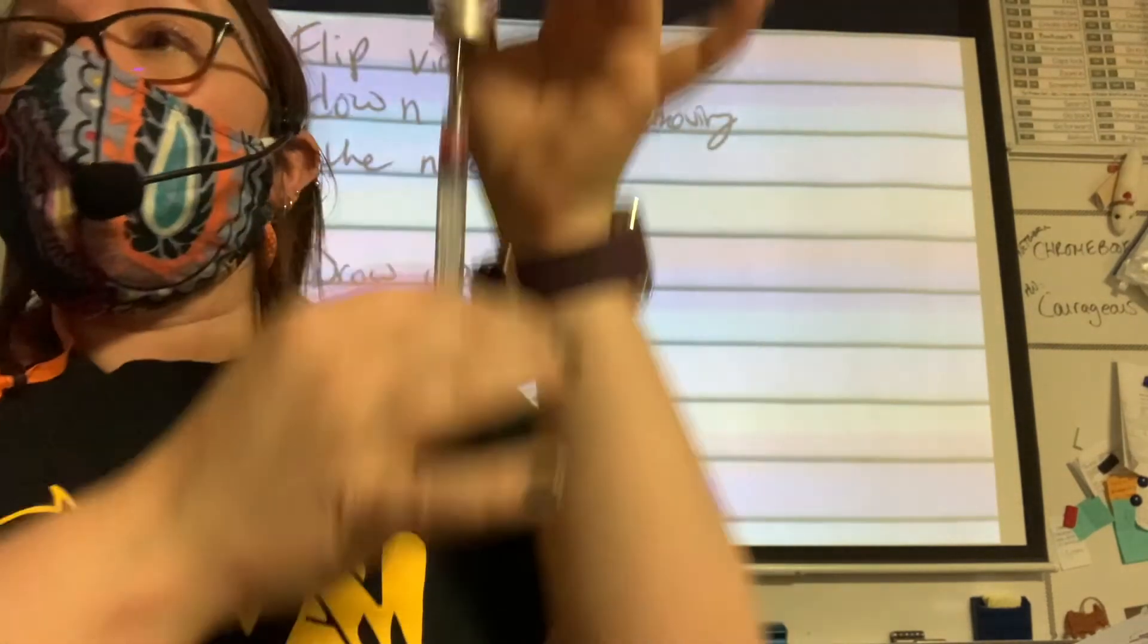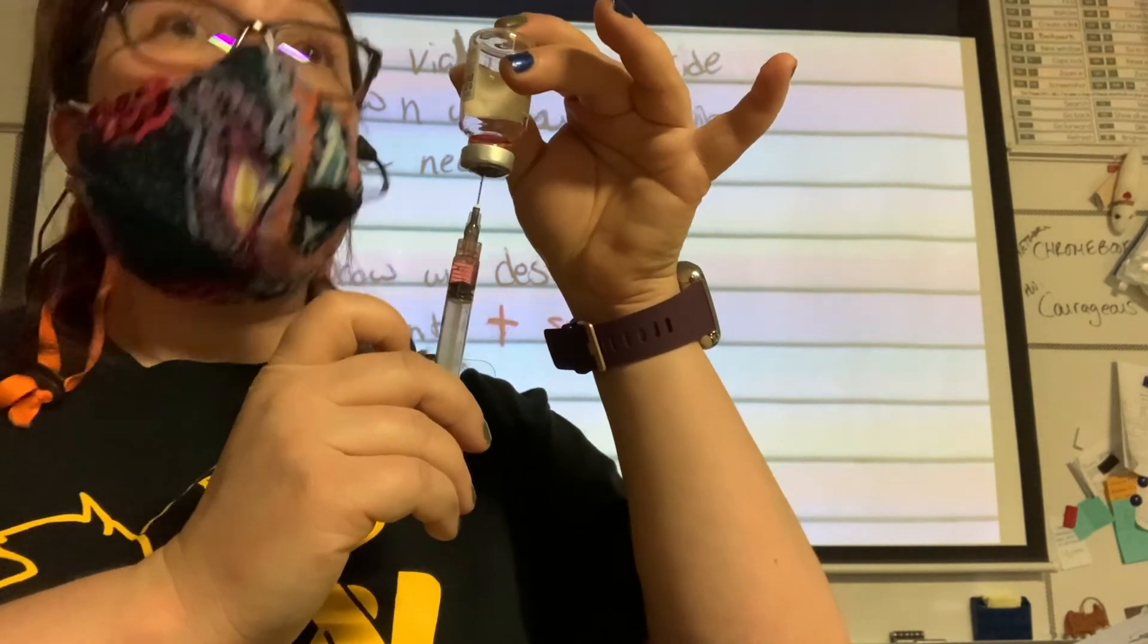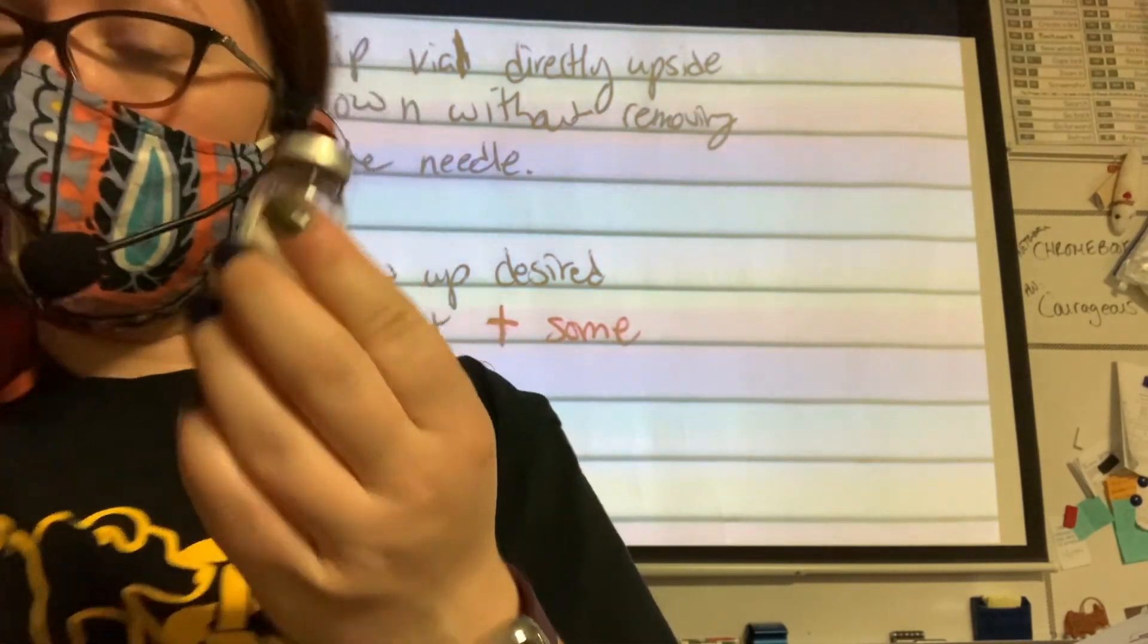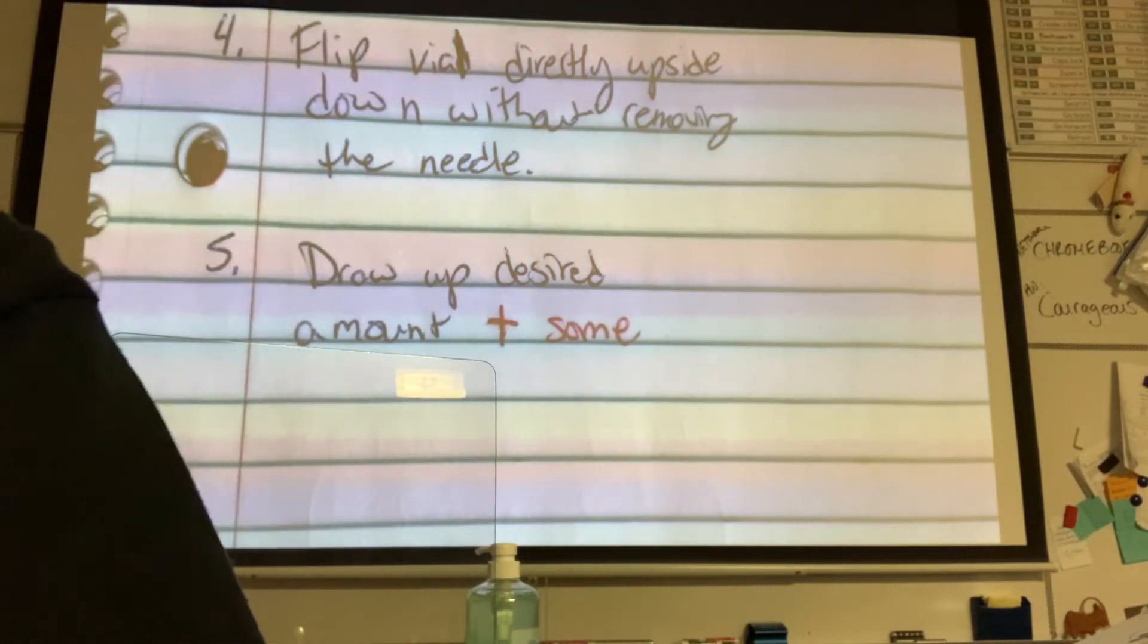So step eight is the student places syringe in the sharps container. After I get how much I want, and you guys will notice the needle is going past the liquid. So all I'm doing is pulling that down. Once I have what I want, my 0.5, if I pull straight out right now, my bottle, there's a chance that medicine can go where? Out of it. Right? So I'm going to flip it back over, then I'm going to remove. So that's how we kind of change those last few steps.